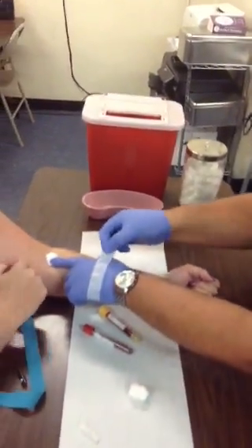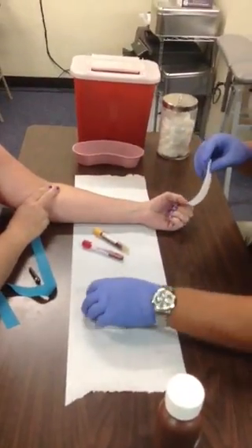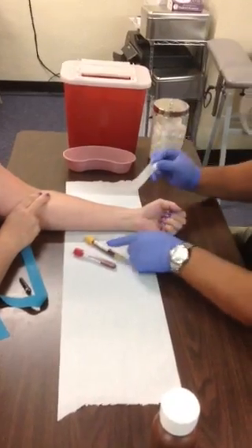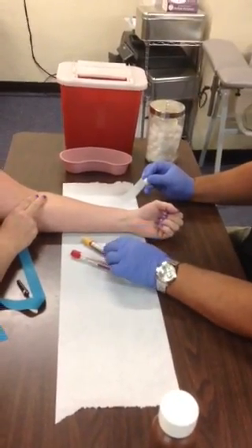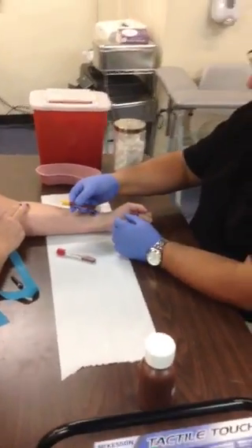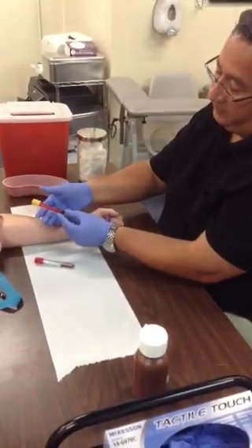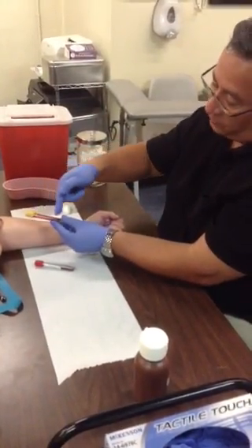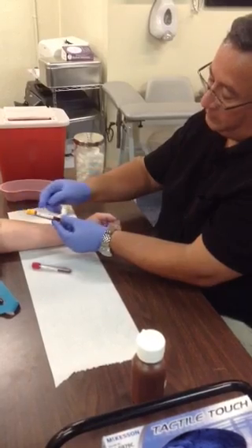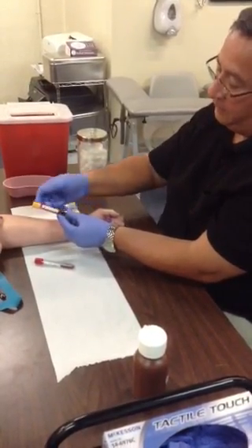If the patient wants tape, put the tape on. At this point, label your tubes and show them. Remember that when putting your tube into the adapter as you're getting ready to draw blood, the tube label should always be facing down so you can watch the blood fill in. If the tube label is facing up, it's going to be difficult to see the blood fill up the tube.